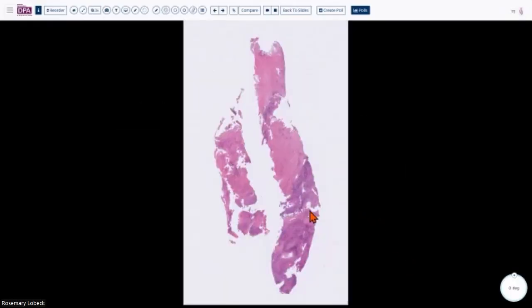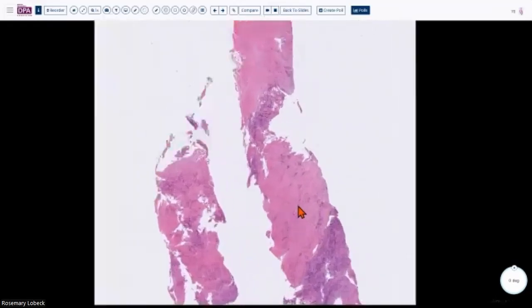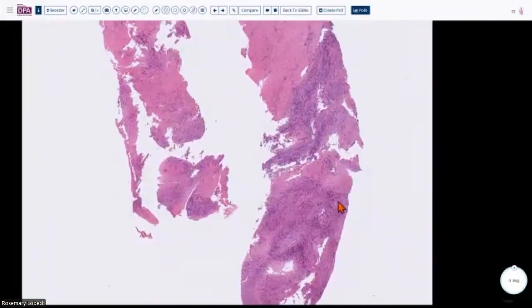But our surgeons are very intelligent. They know much better than to just take it out. So they did a biopsy. So here you can see mostly it's a fibrous tumor, and then here's the cellular area.